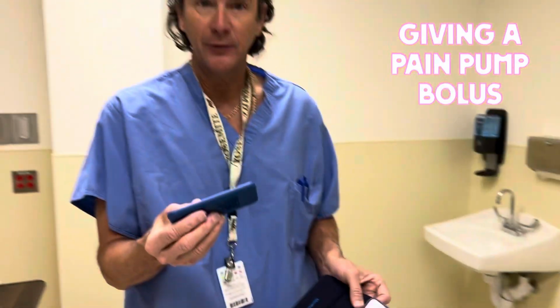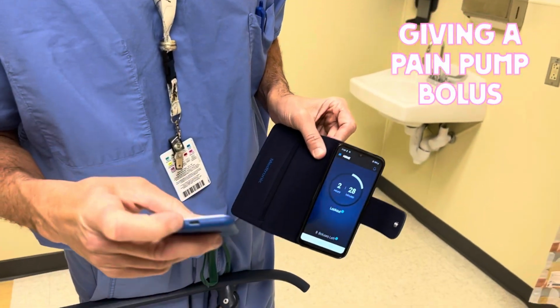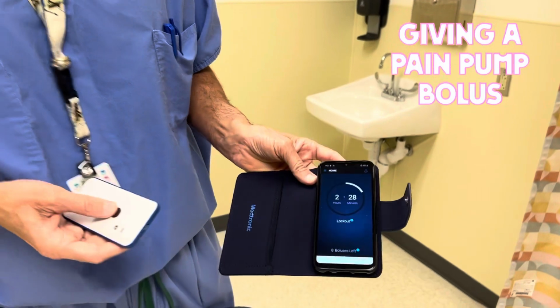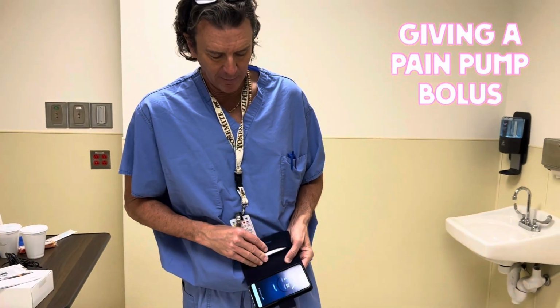Now, this device and this device have to be charged. This device has a little port on the end. The chargers come in the pack with it. And this device, the charger's on the end just like any phone. So once you're done, you slide this back in there.